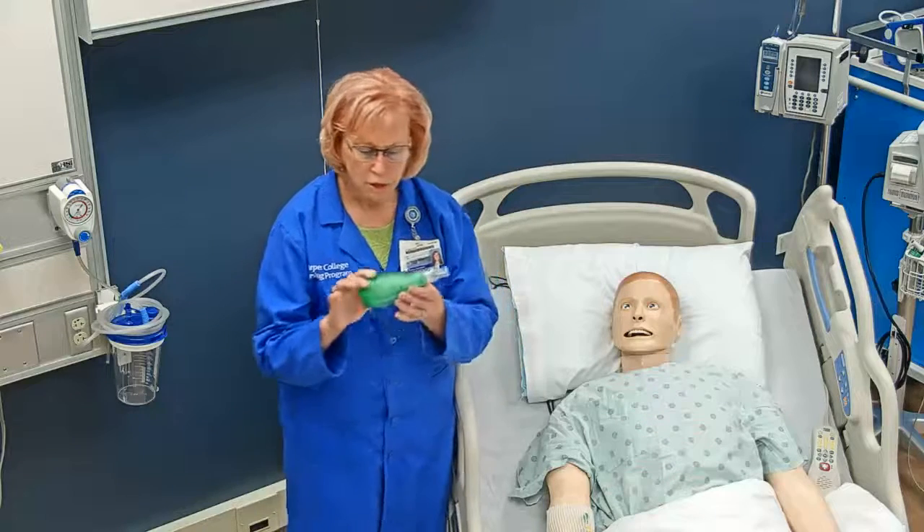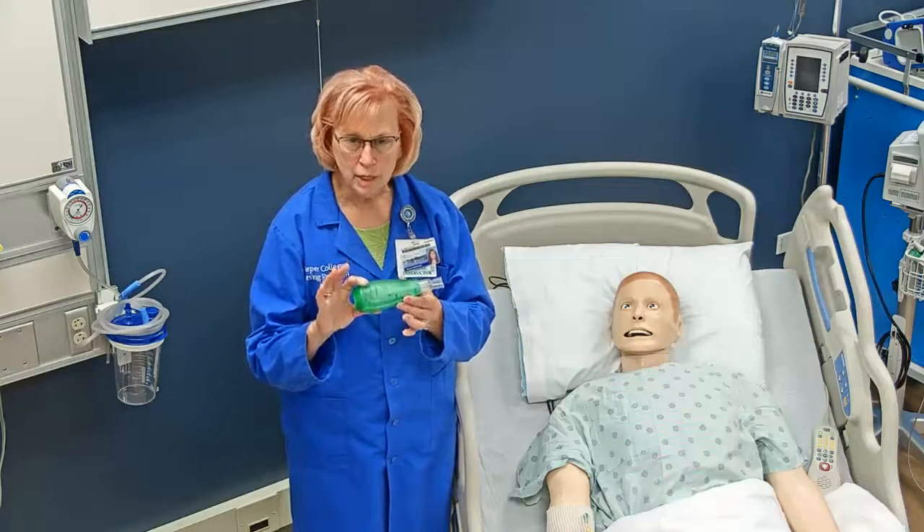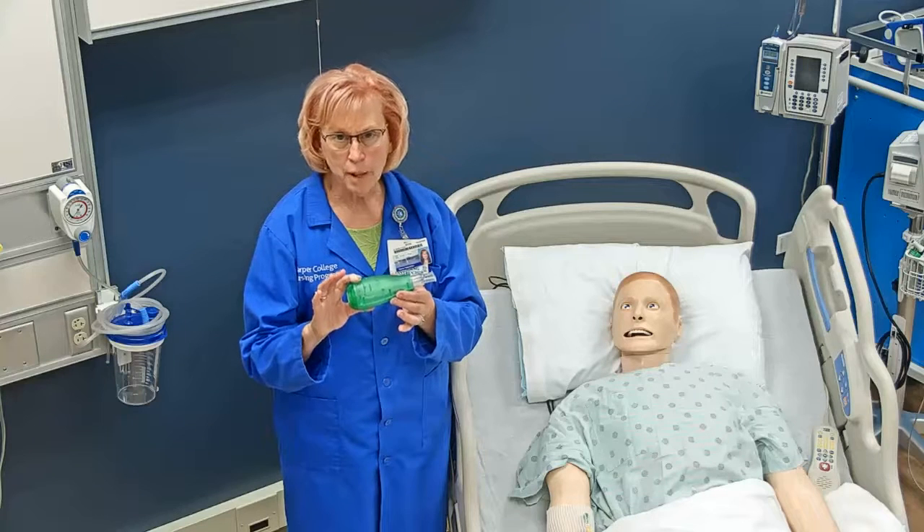That is all for how to use the Acapella vibratory PEP device.